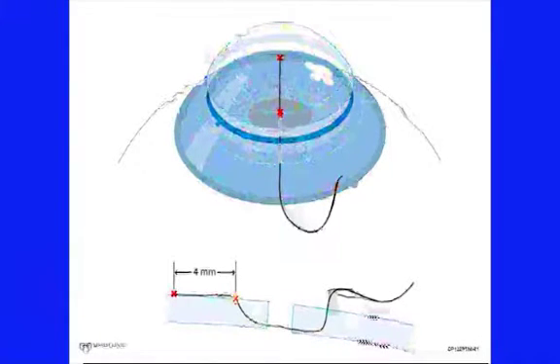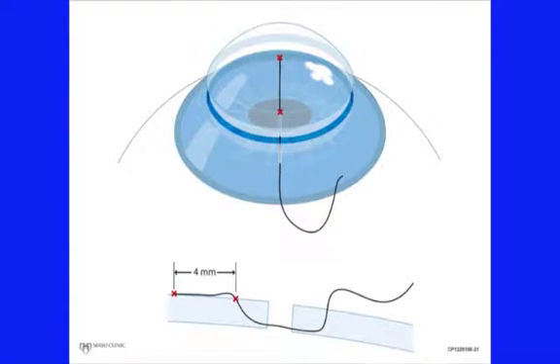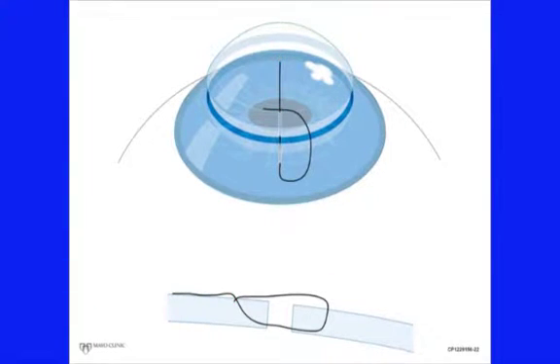Next, pull the suture through the wound until 4 millimeters of suture is left on the graft side of the wound. Next, we make what we call the T. We place the long portion of the suture on the host and place it perpendicular to the short graft suture. The long suture should point towards the non-dominant hand and the two ends should intersect where the short suture enters the graft. This T position will be the same for every suture you place around the graft perimeter.